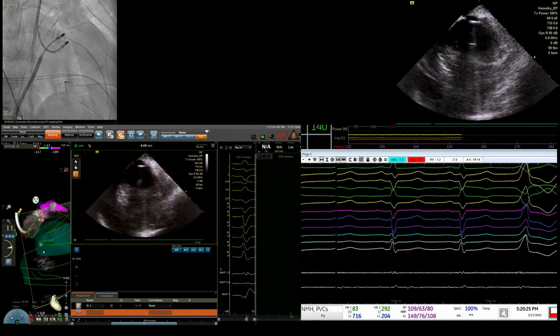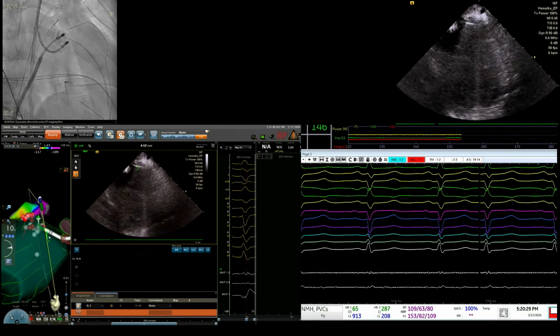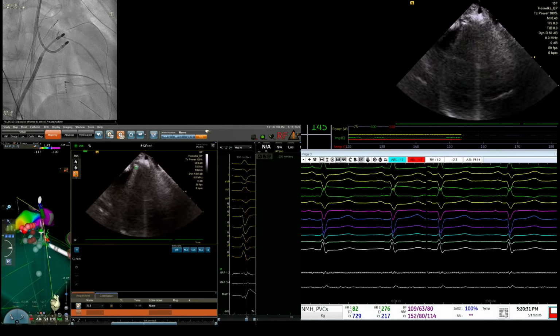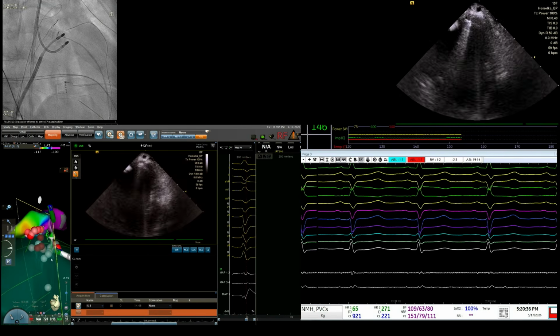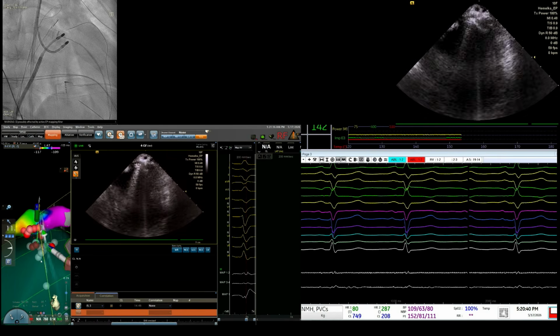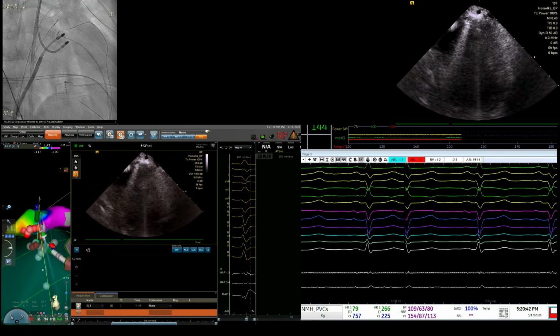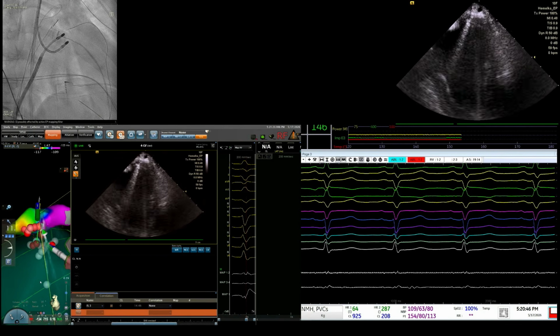That's the top of the left ventricle, and opening more takes me to the appendage, and then you're right opposite to the AIV and the circumflex. So this is very basal, proximal, below the left coronary cusp. Some people call this AMC, but you can see on ICE that this is not AMC, this is pure left ventricle. All right, thank you.